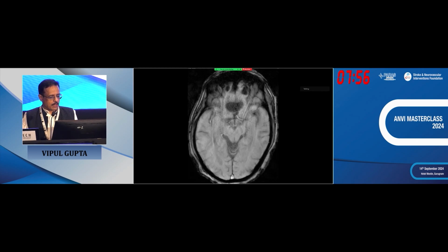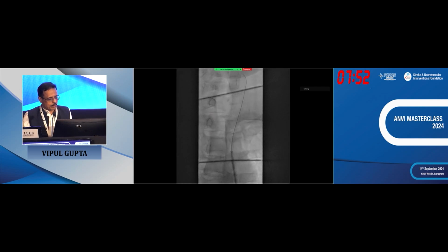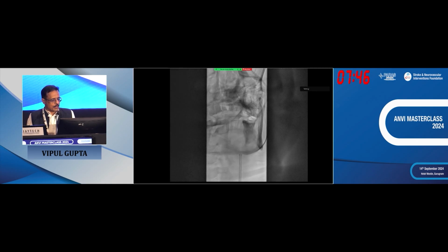That's the MRI. Can we speed up the video? Okay, so this is the Neuron Max guiding catheter we took in, and we did try to aspirate a bit. It's just not going to work.